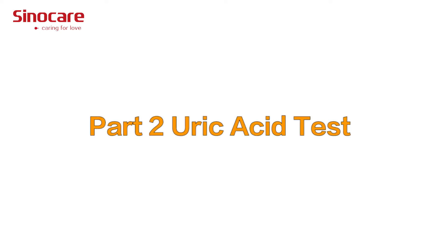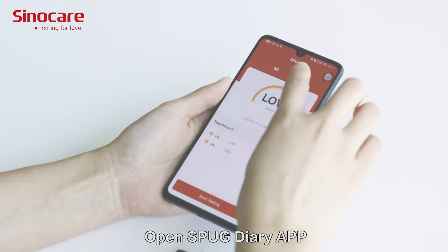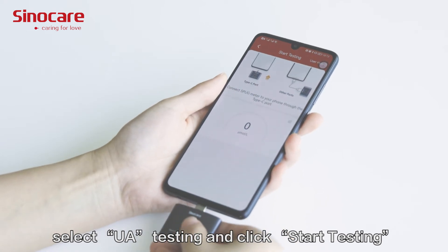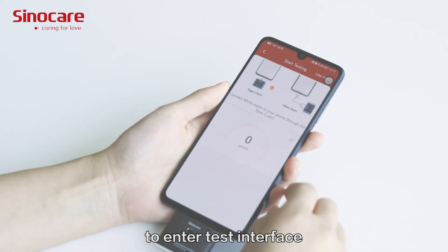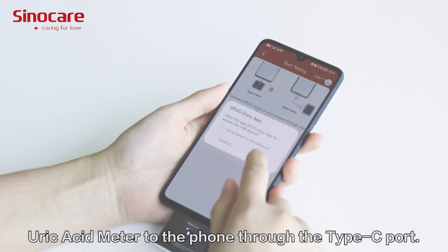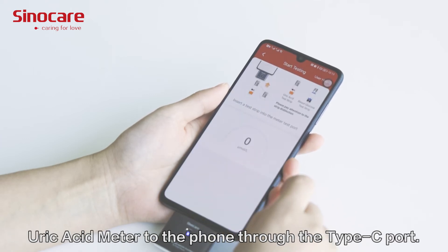Part 2: Uric acid test. Open the SPUG Diary app, select UA Testing, and click Start Testing to enter the test interface. Connect the SPUG Blood Glucose and Uric Acid Meter to the phone through the Type-C port.